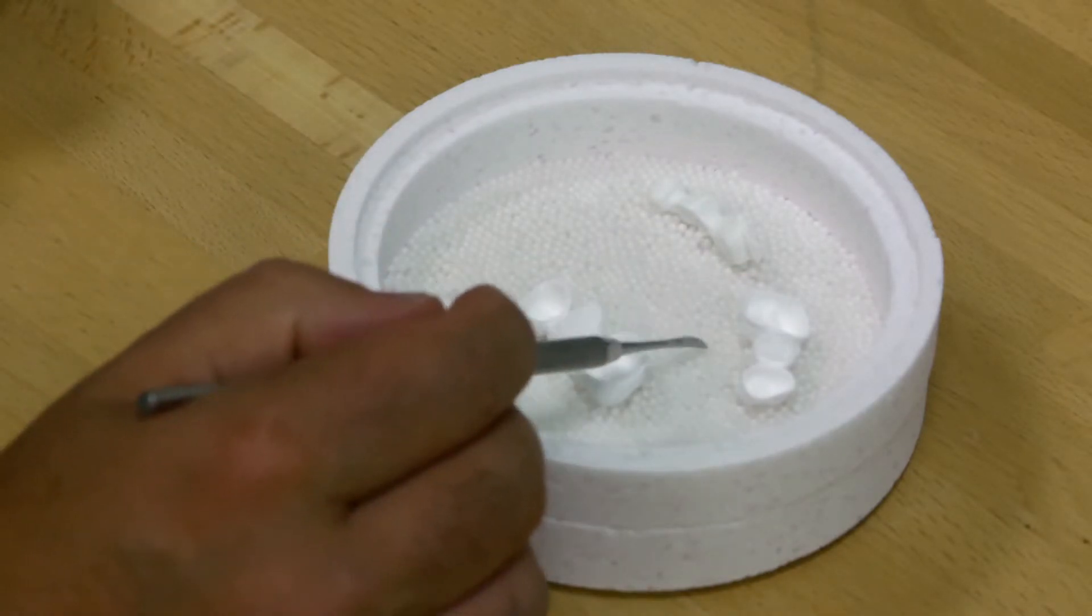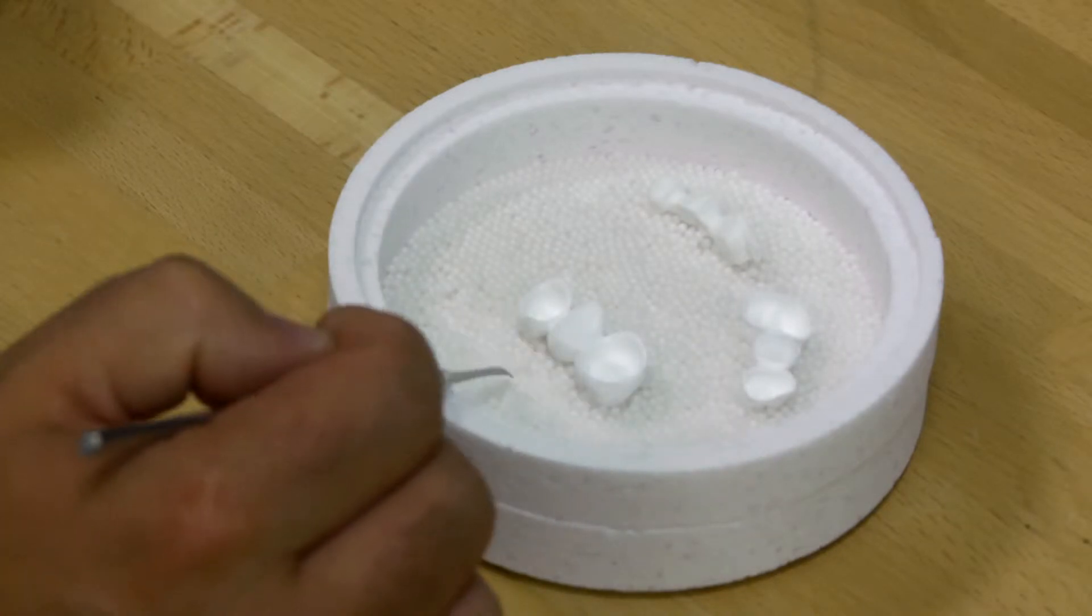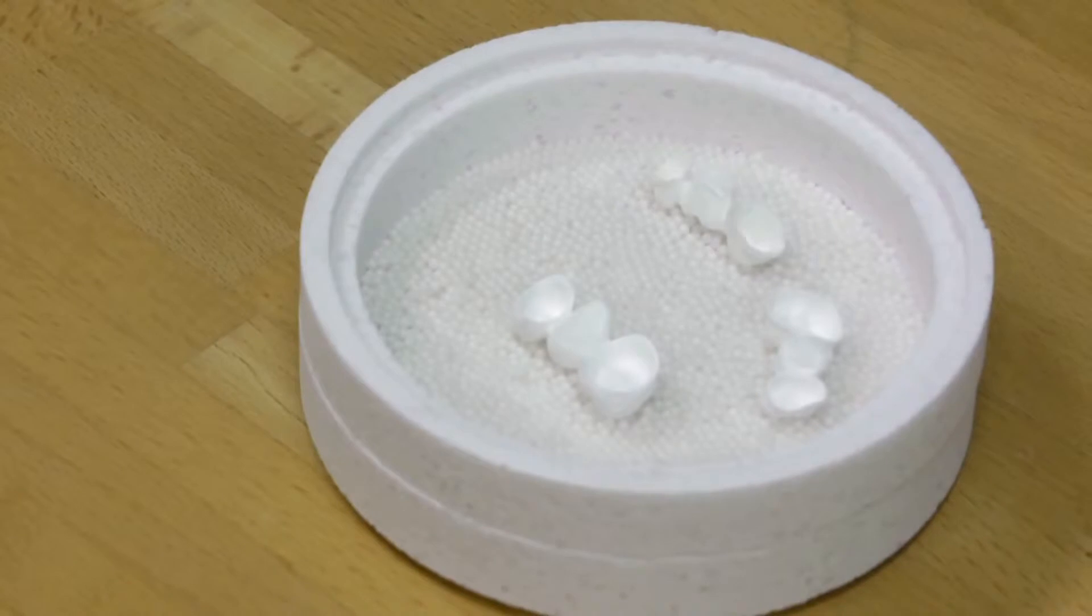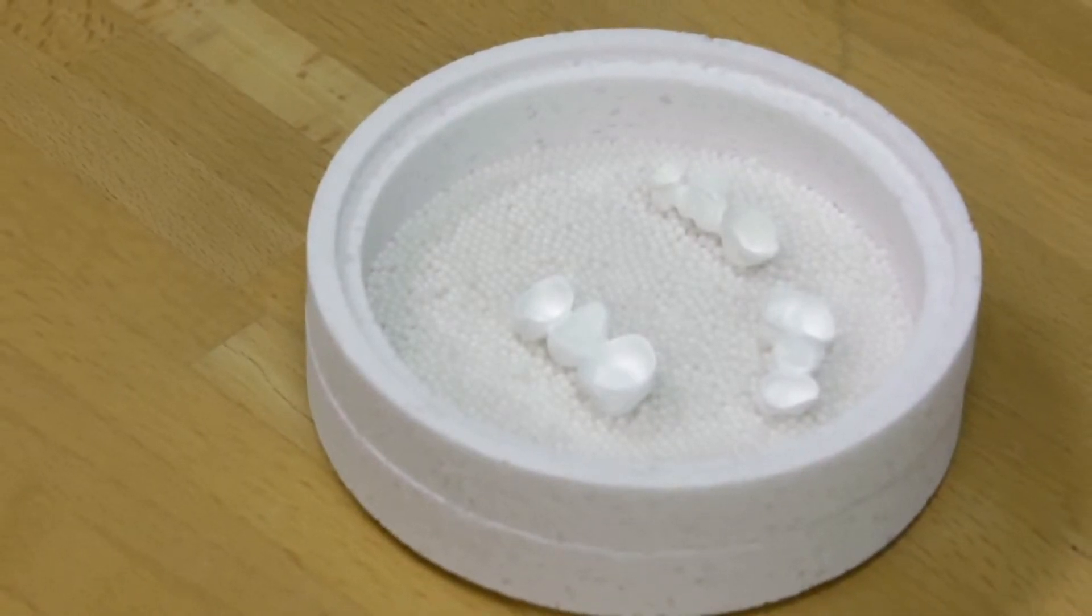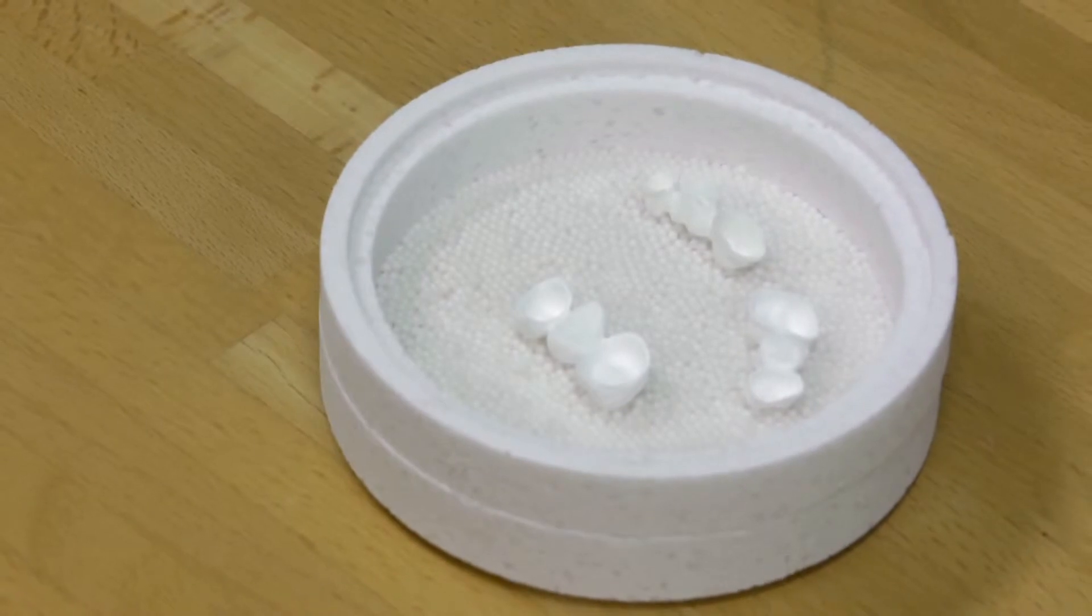If several restorations are sintered at the same time, these must not touch the edge of the sintering tray or each other. In order to prevent the sintering beads from sticking, such as interdentally on the bridge pontic, the restorations must not be pressed or embedded into the sintering beads too hard.